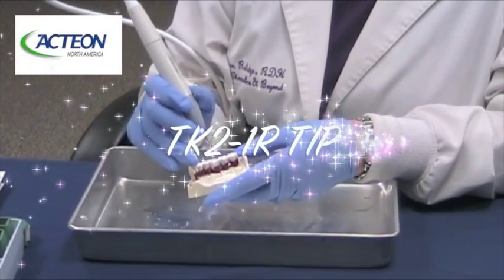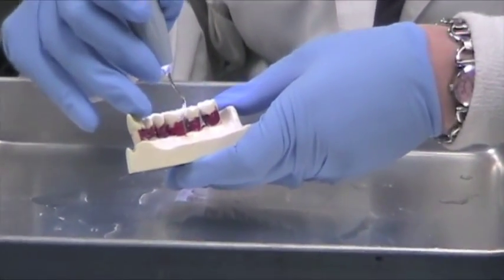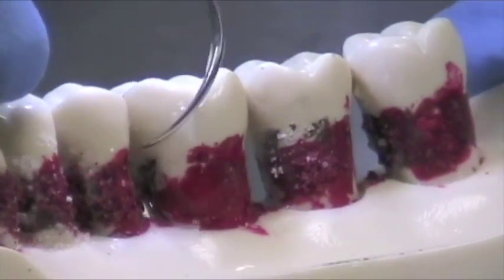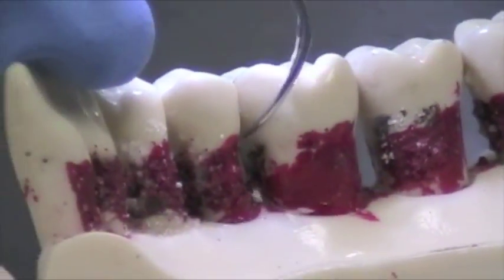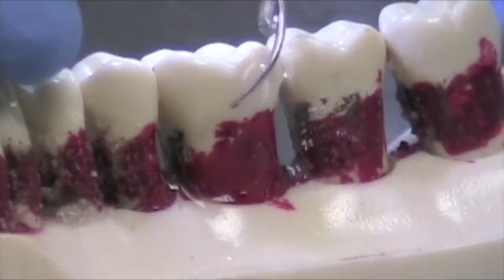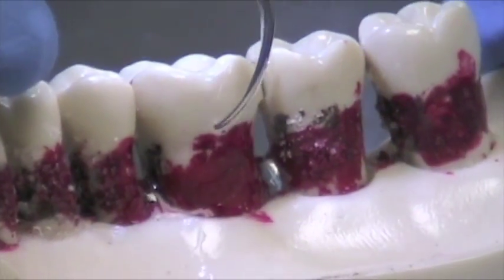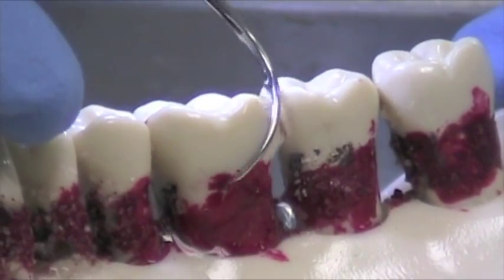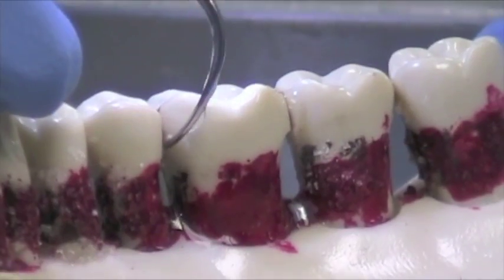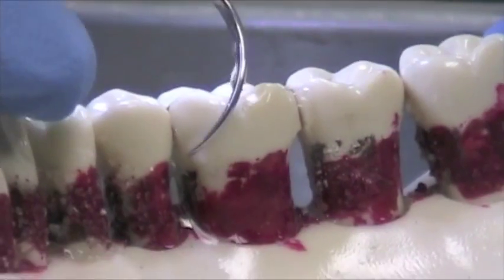Now I'm going to demonstrate the TK-2-1R. This tip is for posterior teeth for biofilm debridement. Again, we're just going very lightly — feather light touch. This tip looks like a Nabers probe, and if there was a furcation here, many of you watching would know that tip could just slip right into the furcation and get to the base or the bottom of the furcation — clean that out very well. Something an instrument couldn't do because we have the benefit of cavitation and lavage.